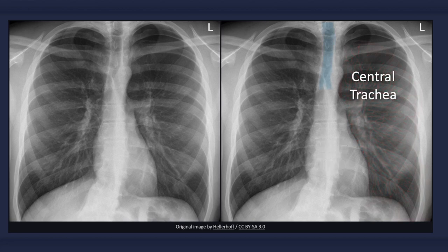With a simple pneumothorax, the heart and mediastinal structures remain in their natural positions. For example, notice the central position of the trachea in this X-ray.